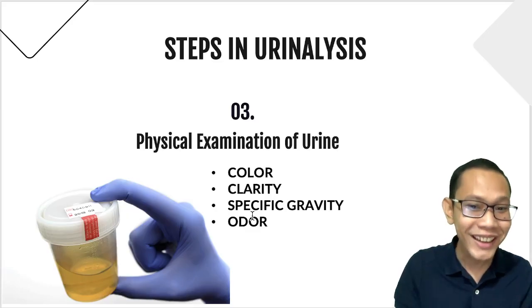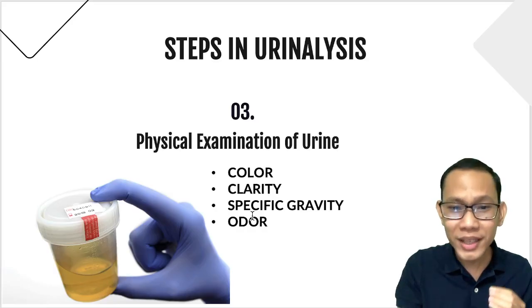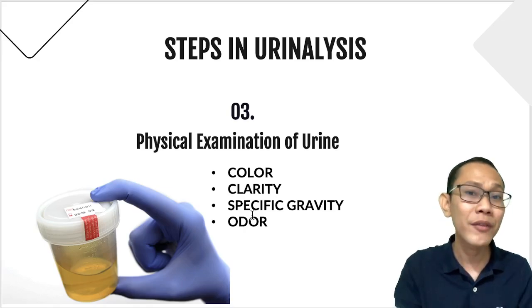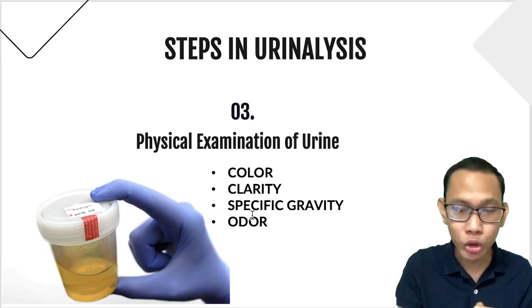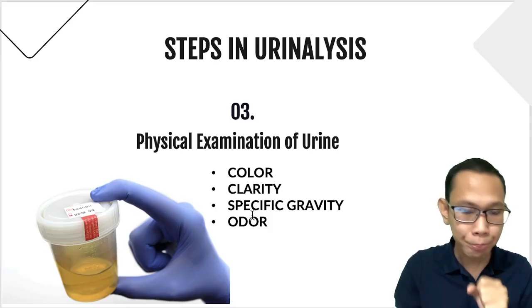Of course not. As in our physical examination, this discussion will only focus on the color, clarity, and specific gravity. The other parts will be discussed thoroughly in your lecture counterpart. So you will also have a lecture discussion of your physical examination, but my role here is mostly the laboratory aspect of your physical exam.